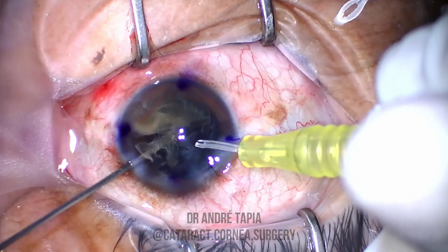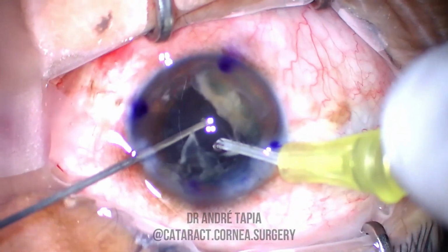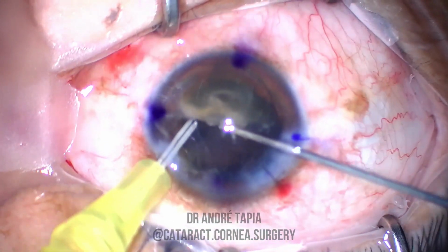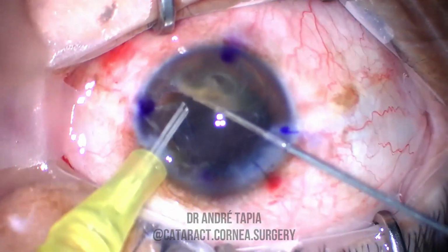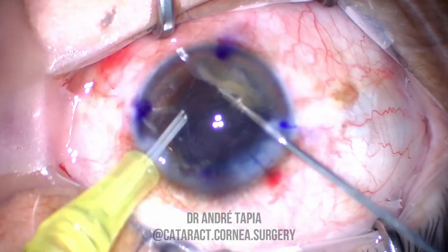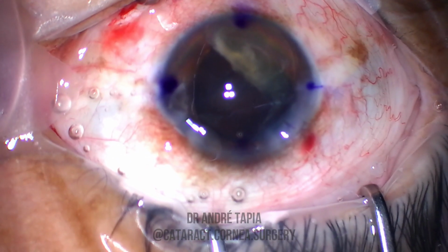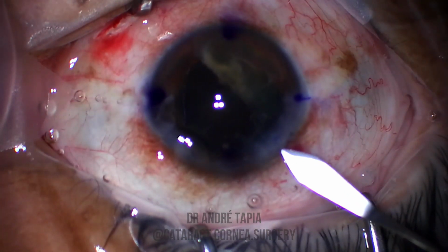Remember that during vitrectomy, you need to have a hermetic chamber to prevent the vitreous from escaping. In this case we have 2 areas of probable vitreous protrusion, the posterior rupture in the inferotemporal region and the zonular dialysis in the nasal area. Both areas need to be monitored to prevent vitreous prolapse.